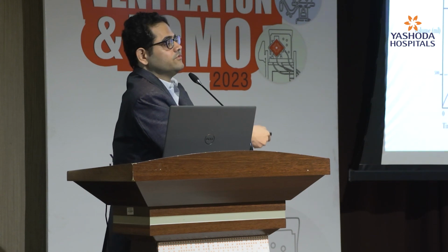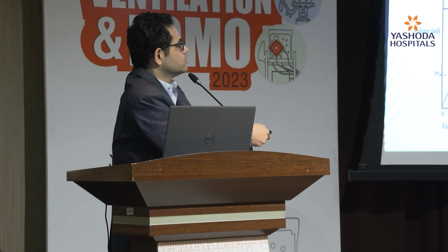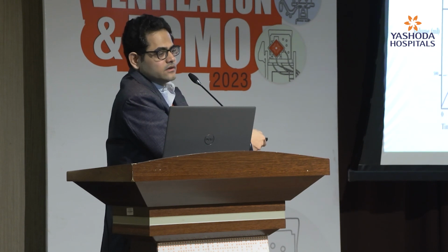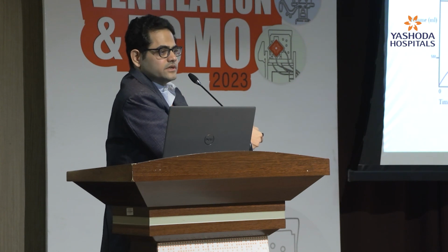So how will you define the volume control breath in the control mechanical ventilation? It is a time trigger, flow limited, and volume cycled. Okay, understood?